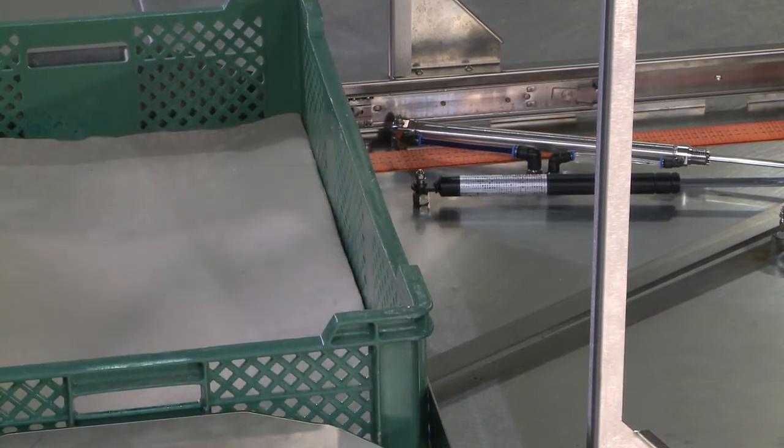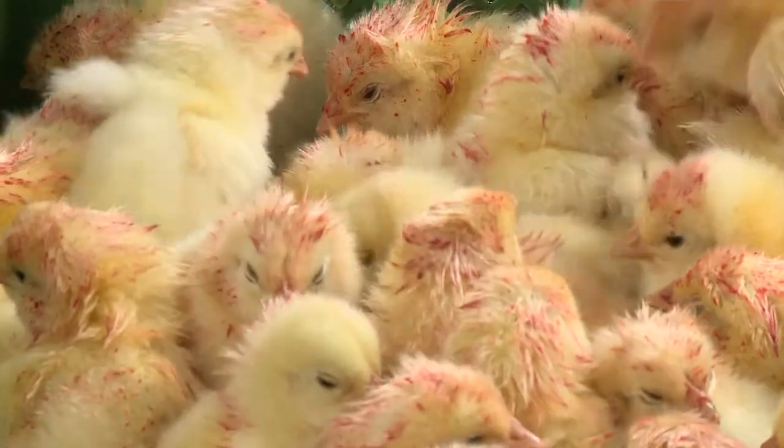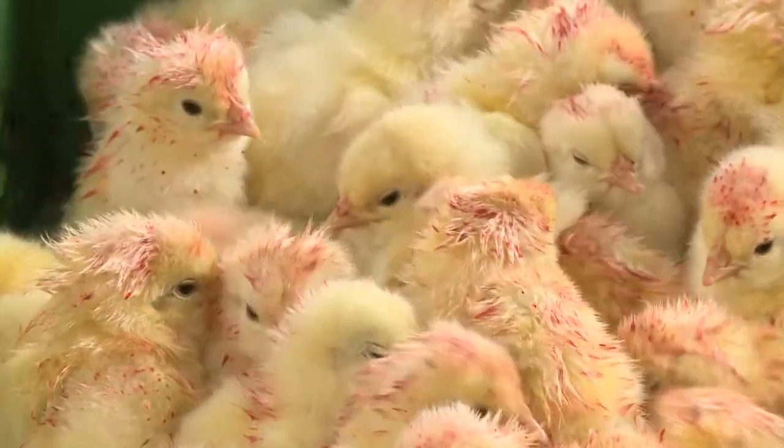Adding a dye to the vaccine solution helps to check the preening activity of the chicks after vaccination. If dye is mixed with the vaccine solution, the vaccination process can be confirmed about 5 minutes after spraying the chicks.